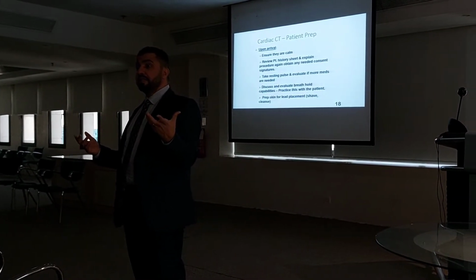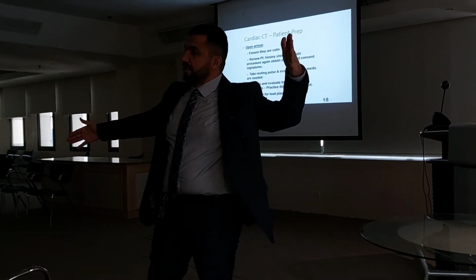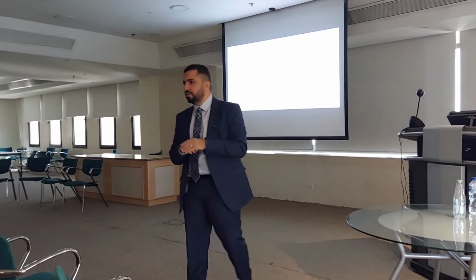Full inhalation, yes. But he cannot take a very big breath-hold, and the second time he cannot do that. You need to train him well.